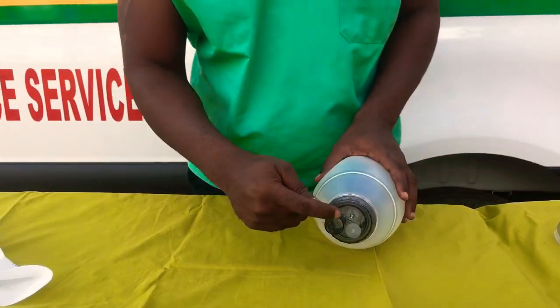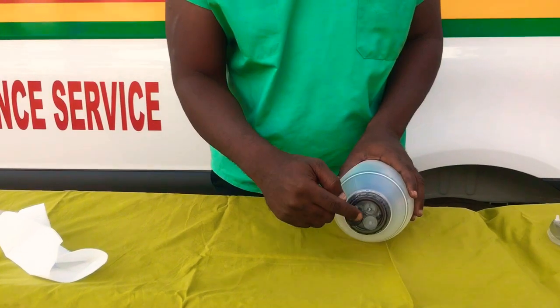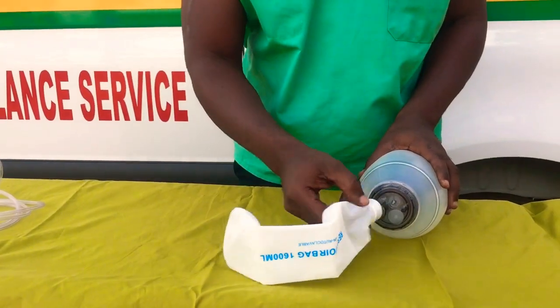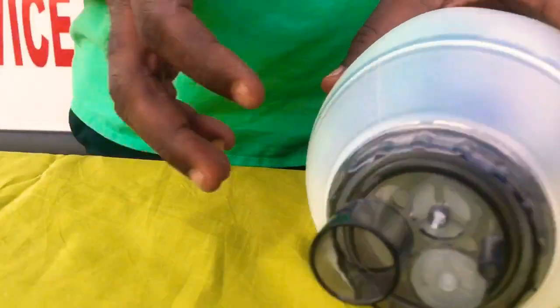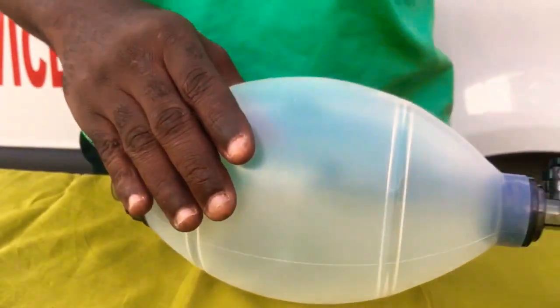Now we have the reservoir. As I said earlier, this bigger hole is what we call the air inlet, where you can also fix the reservoir. And then this smaller hole is what we call the oxygen inlet, where you'll be fixing the oxygen connecting port. And we have the mask over here.